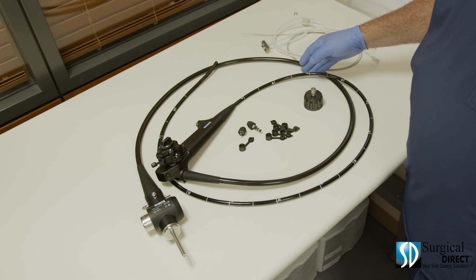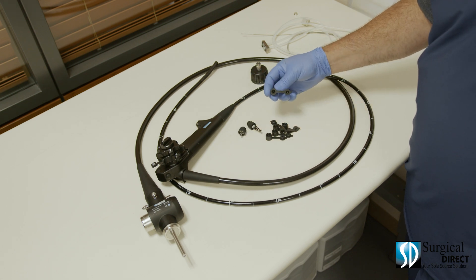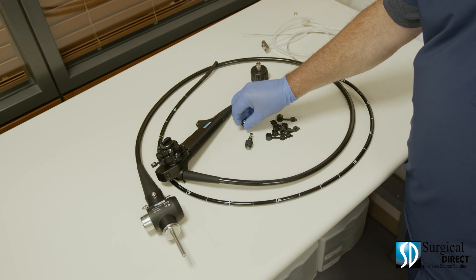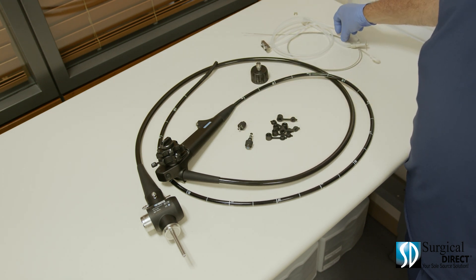This is our one and a half meter Veterinary Endoscope. It includes a soaking cap, extra biopsy port caps, an air water valve, a suction valve, cleaning adapters, and a cleaning brush.